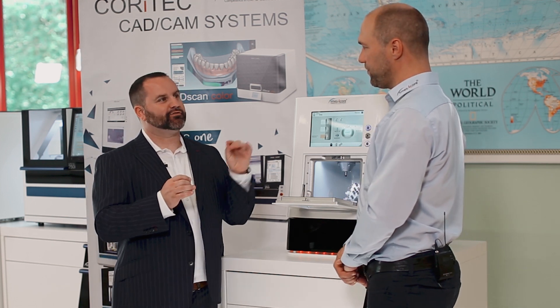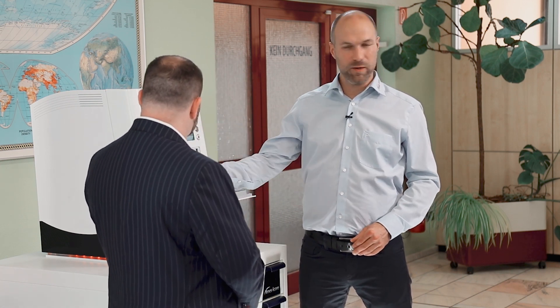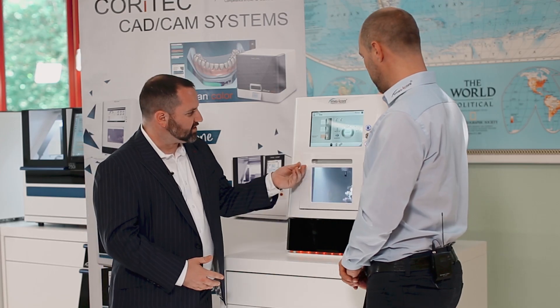How many blocks could you fit in this machine at one time? As you can see here, we can put in three blocks. A special point is that this bar where you put in the blocks is changeable — you can take it out of the machine and put in a different kind of adapter system. So maybe for the pre-milled systems, or we also have another block which can hold a zirconia block up to 60 by 40 by 25 millimeters. That's great!